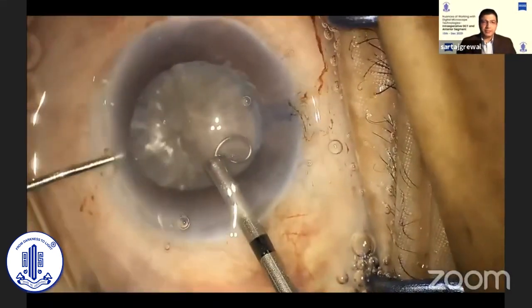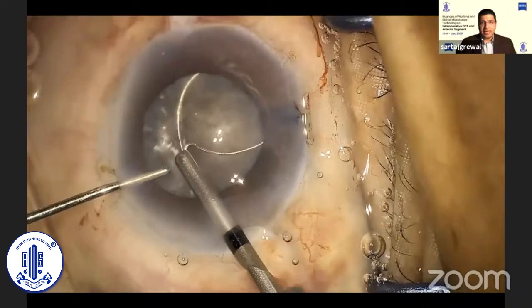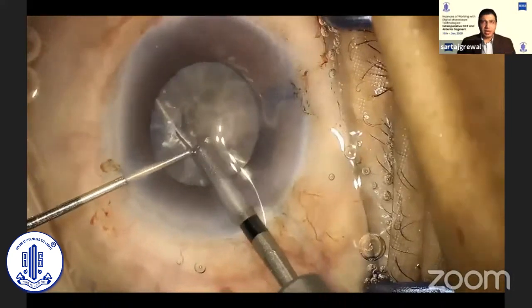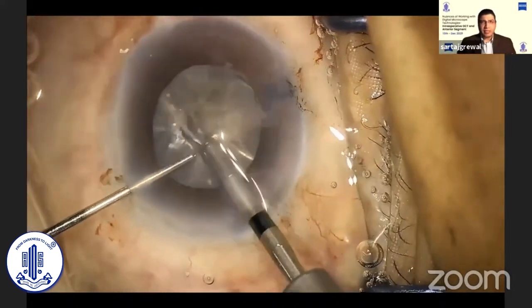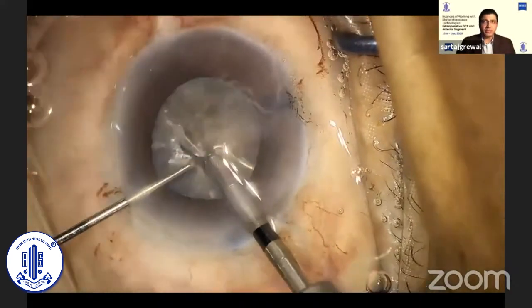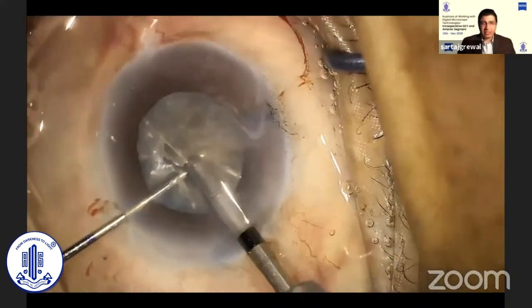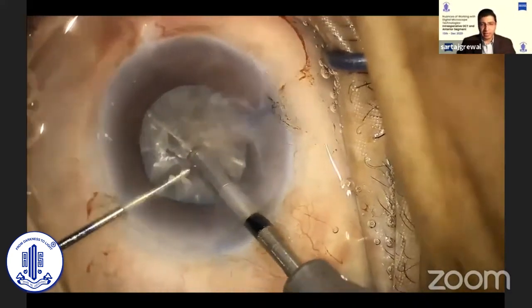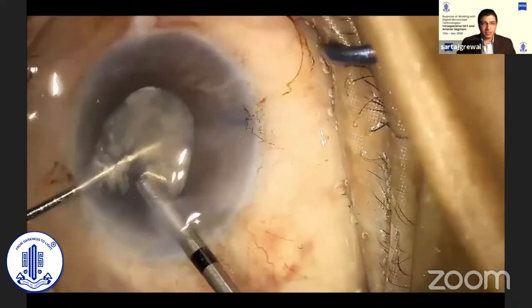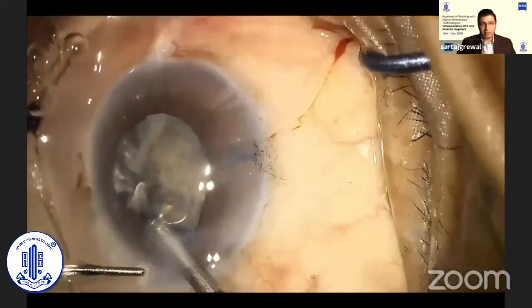Using a second instrument at the time is very helpful, particularly in these cases with very dense cataracts. It helps stabilize the nucleus as you're retracting the loop, because as the loop retracts, it tends to push the nucleus up and out of the capsule bag. Sometimes after dividing the nucleus, there can be a small isthmus of a few nuclear fibers between the two halves. The second instrument can allow you to dissect these fibers carefully and remove the MyLoop without causing any damage. So in this case, after retracting the filament, there are still some fibers encompassing the MyLoop, and using the second instrument you can gently dissect the fibers and then remove the MyLoop carefully.